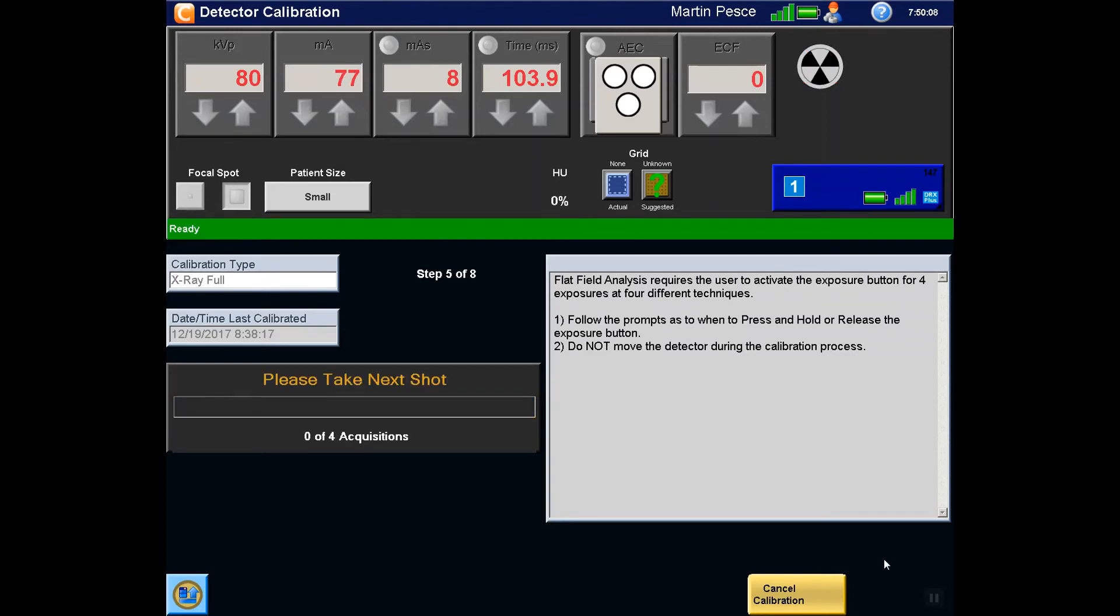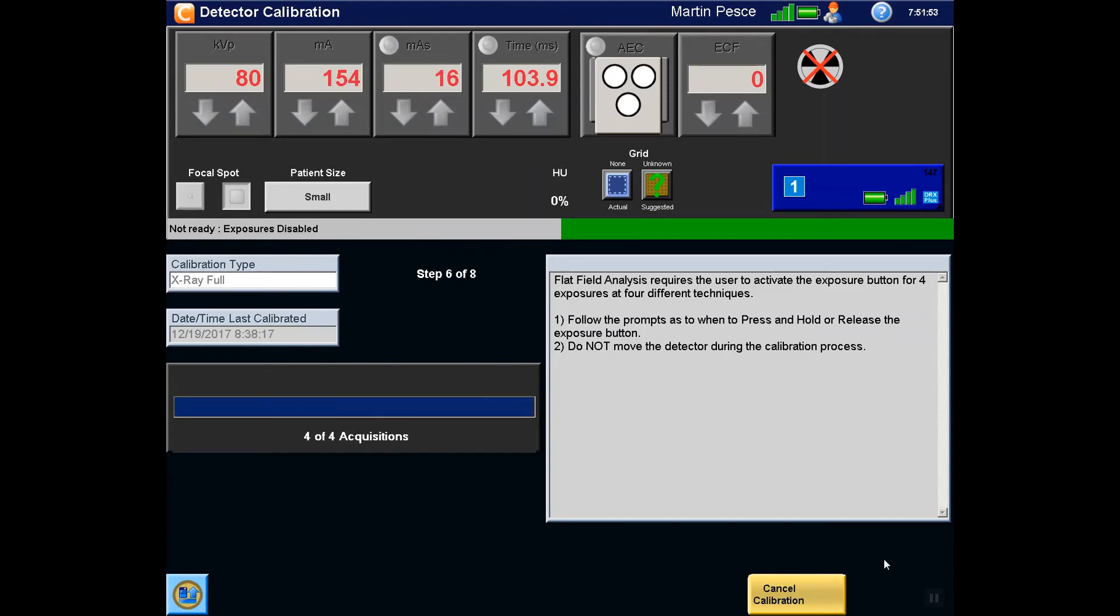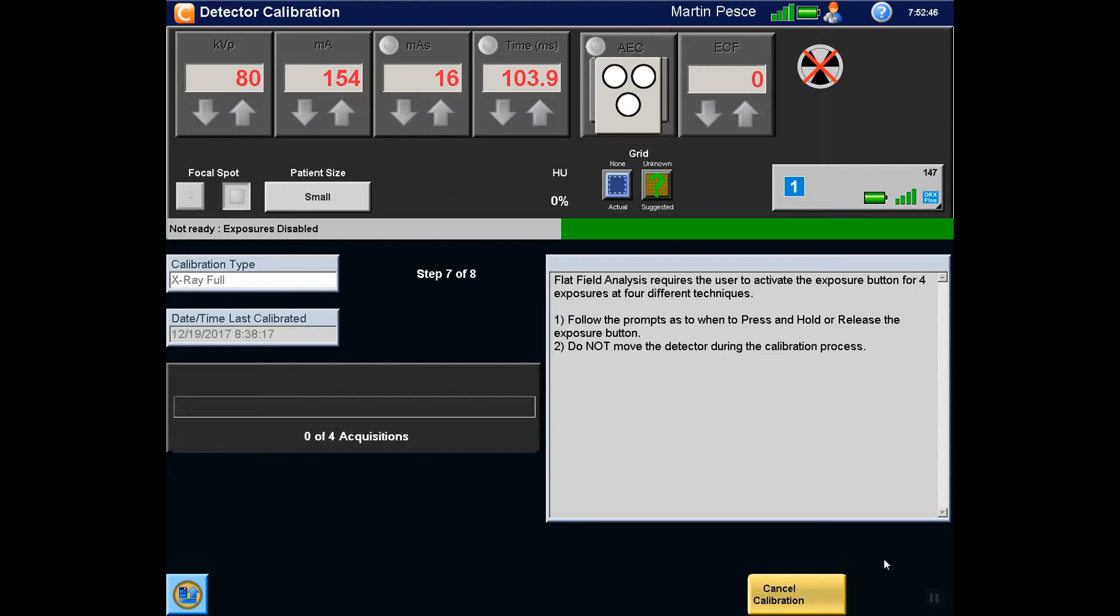Step 5 will require the radiographer to acquire 4 more exposures when prompted. Step 6 is another automated process. Step 7 will require the radiographer to acquire 4 more exposures when prompted.